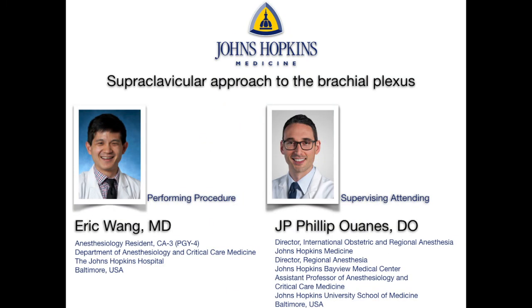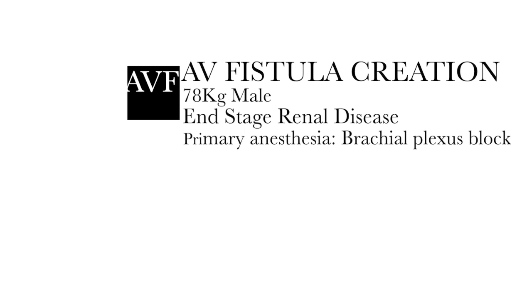Johns Hopkins Medicine proudly presents this brief 3-minute video tutorial on the supraclavicular brachial plexus block for the purpose of primary anesthesia in a patient with end-stage renal disease.